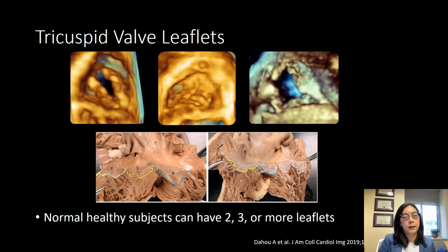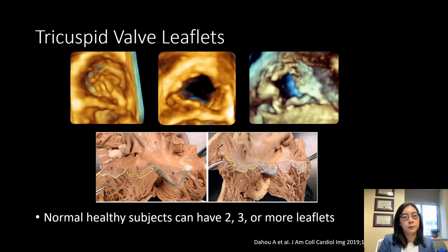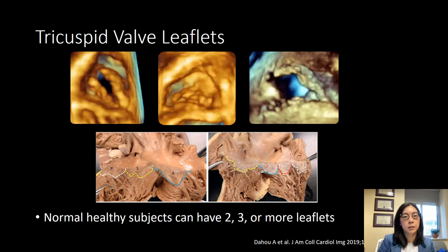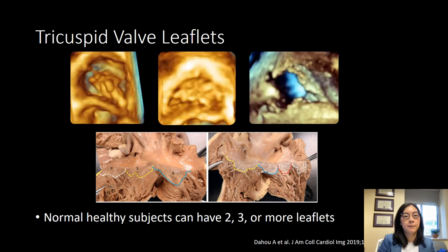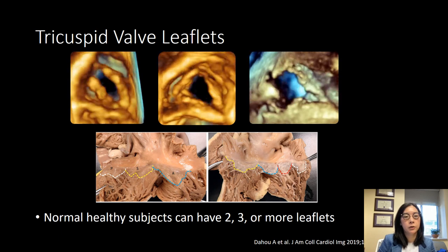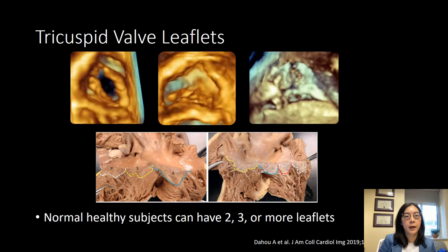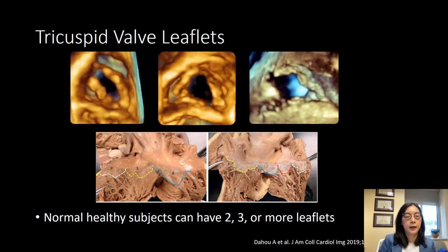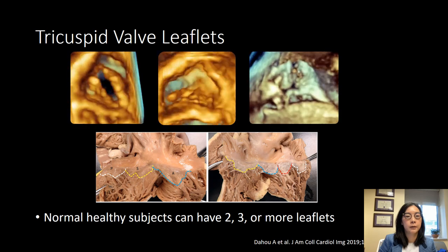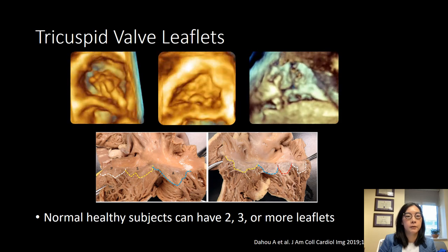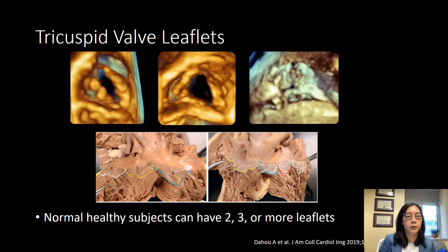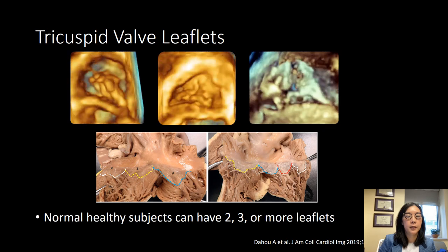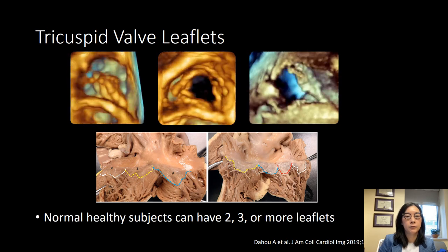The tricuspid valve leaflets can actually vary greatly in number. Normal subjects can have between 2, 3, or more leaflets. In the literature, there have been cases of patients with up to 6 leaflets. If you look at the top row of images, these are 3D transthoracic images of the tricuspid valve as viewed from the right ventricle. The septum is located at the 6 o'clock position. The anterior leaflet is generally at 3 o'clock and the posterior leaflet around 9 o'clock. The top leftmost image shows a patient with 2 leaflets, the middle 3 leaflets, and the right has 4.